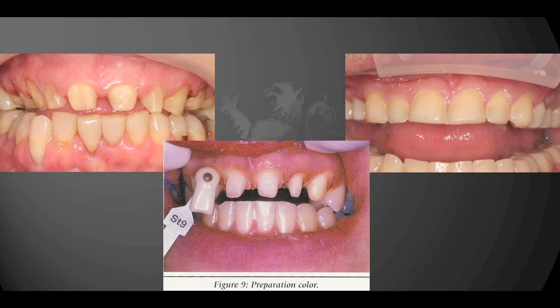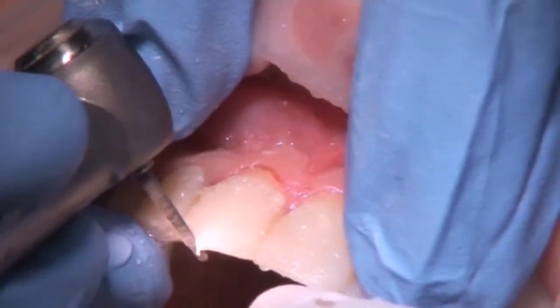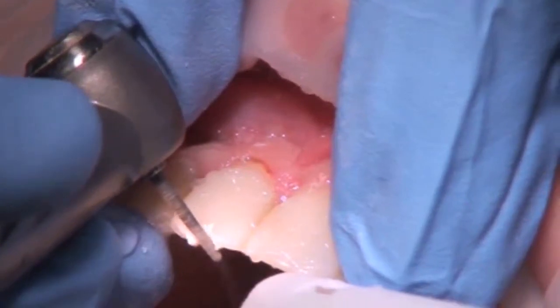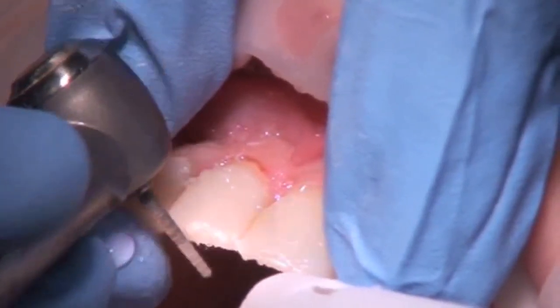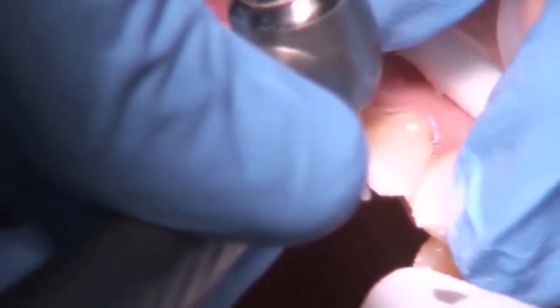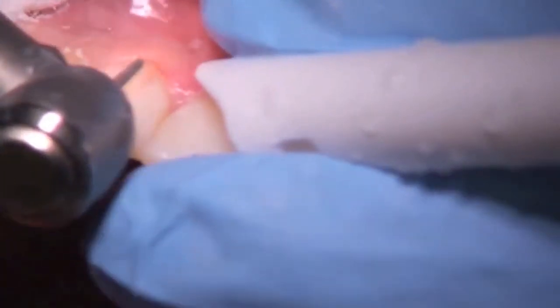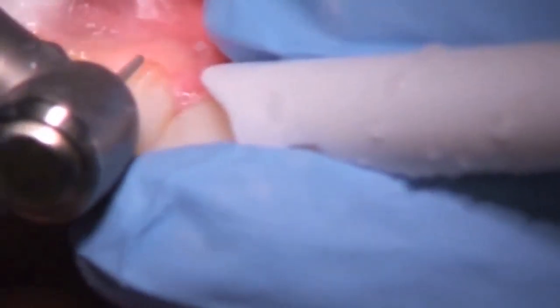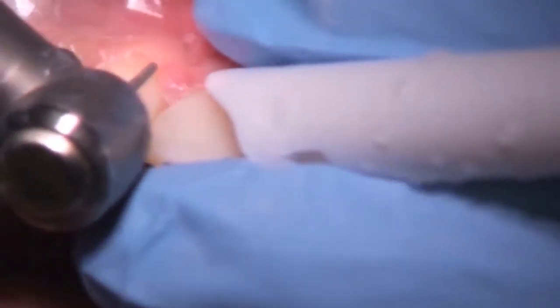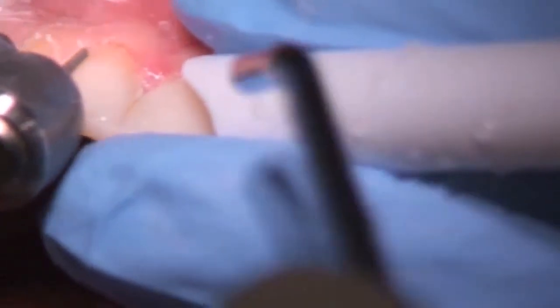The preparation for porcelain veneers varies dramatically by educators and by institutes. Some recommend an approach more like a three-quarter crown preparation where they break contacts. My personal belief and approach is minimally invasive — keep the margins above the gum, don't break contacts. The benefit is that we minimize the amount of enamel we lose, and staying above the gums minimizes the complexity of cementation. I like to reduce 0.4mm in the cervical area, 0.6mm in the middle third, and 1mm in the incisal edge reduction.